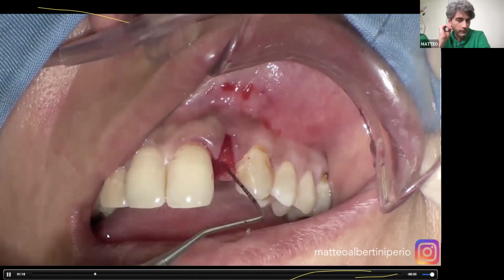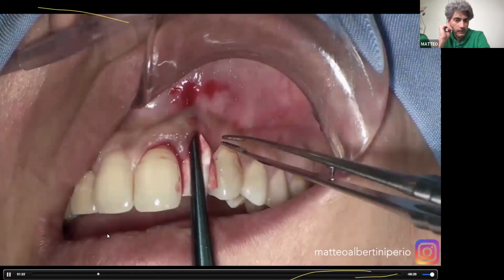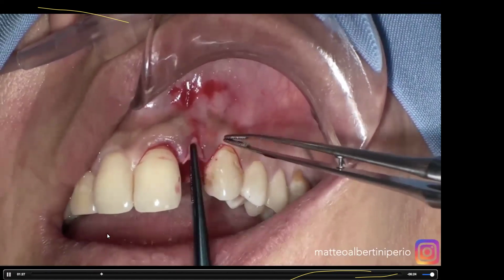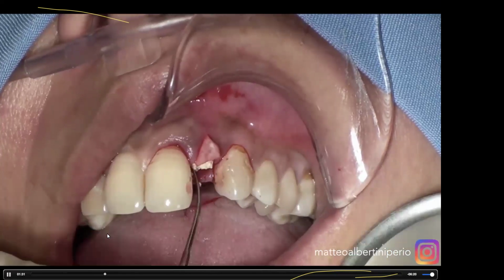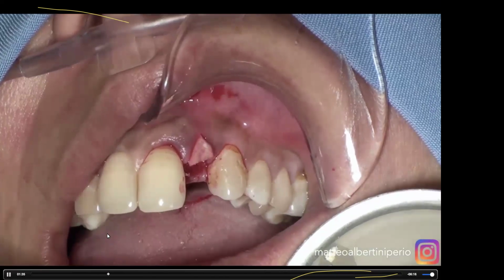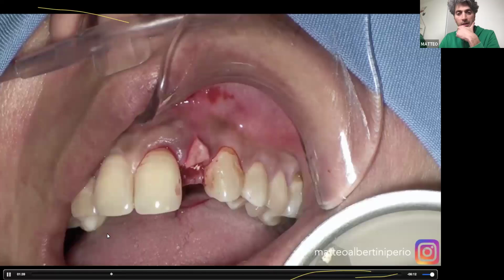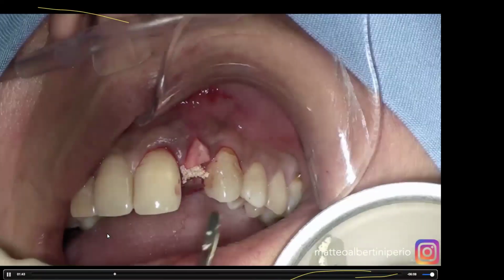So we have tunneled the area. In this case, that is an advanced case, we are using a 3-layer membrane. Итак, здесь мы создали тот самый туннельный доступ, аккуратно укладываем сюда трехслойную мембрану, кейс достаточно непростой. So filling the bone defect by means of xenograft. Заполняем костный дефект ксенографтом.